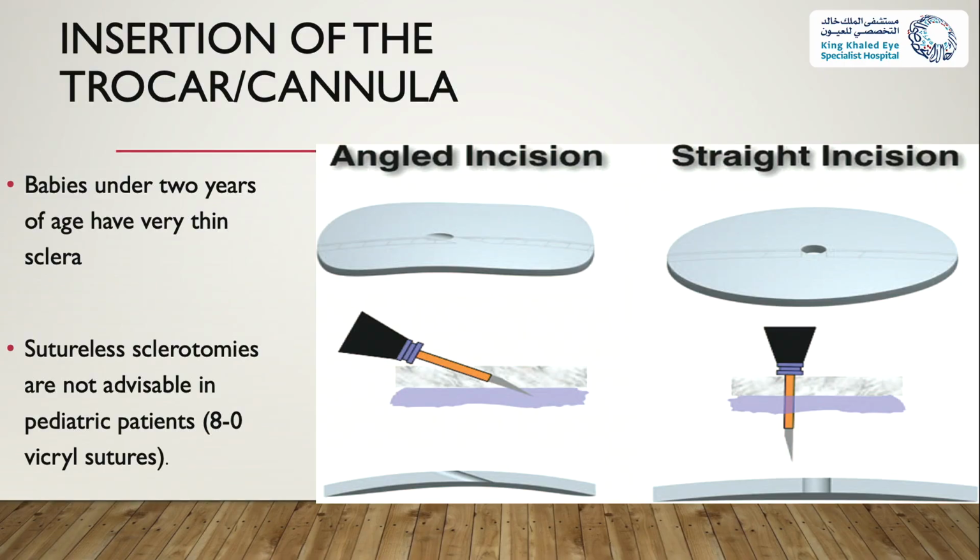So you probably need to suture the sclerotomy for all your cases, and you may as well do the vertical approach that gives you the cleanest and easiest approach, and for the ease of the instrumentation too. I think that makes the most sense.